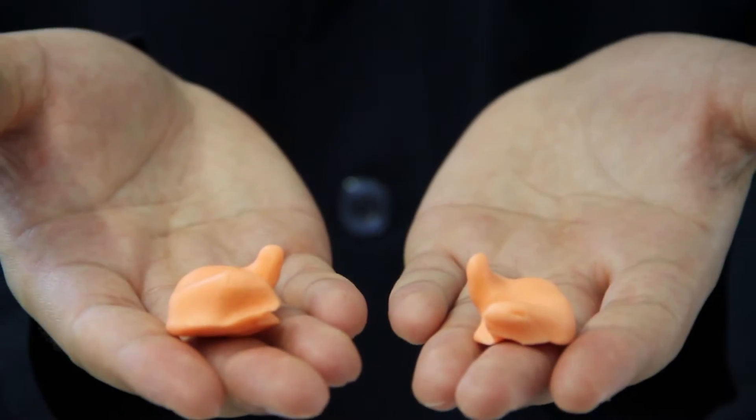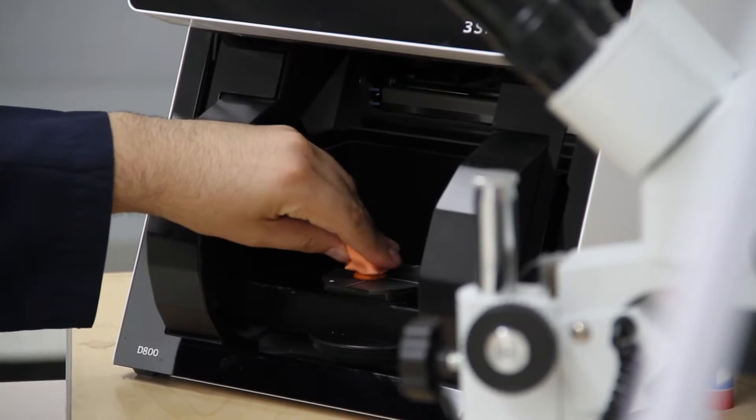First, we make an ear mold which can be purchased online. Then we take our molds and use a 3D scanner to create a shell in STL format.